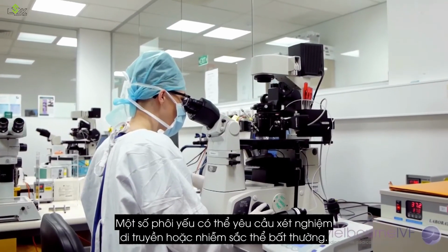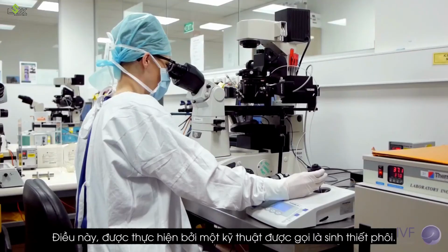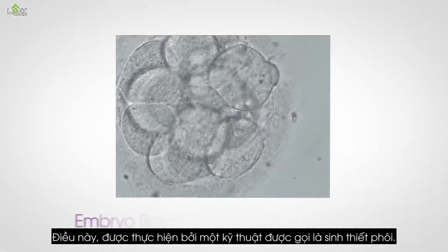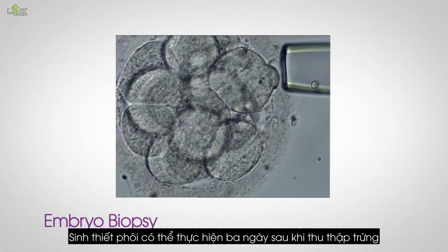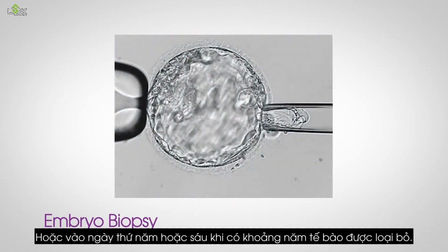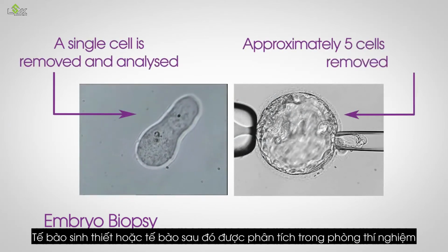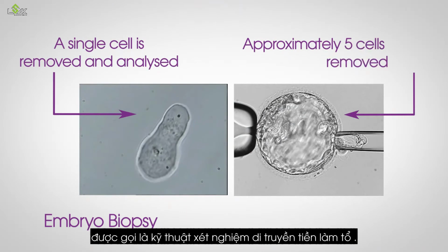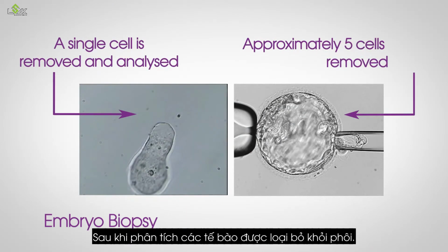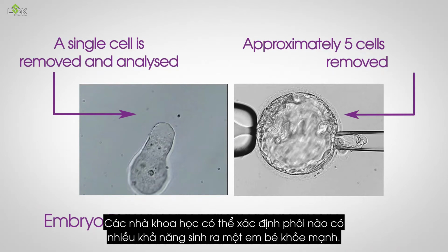Some patients' embryos may require testing for genetic or chromosomal abnormalities. This is done by a technique known as Embryo Biopsy. An embryo biopsy can be done either 3 days after egg collection, when 1 or 2 cells are removed from the embryo, or on day 5 or 6, when approximately 5 cells are removed. The biopsied cell or cells are then analysed in-house at our specialist laboratory called the Pre-Implantation Genetic Diagnosis Laboratory. After analysing the cells removed from the embryos, scientists can determine which embryos are most likely to result in the birth of a healthy baby.